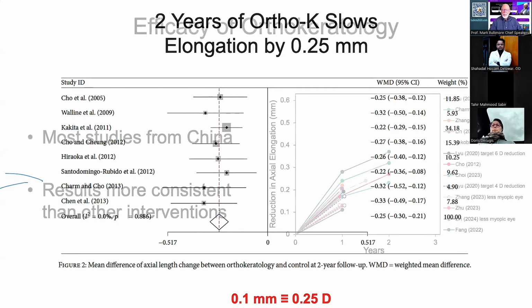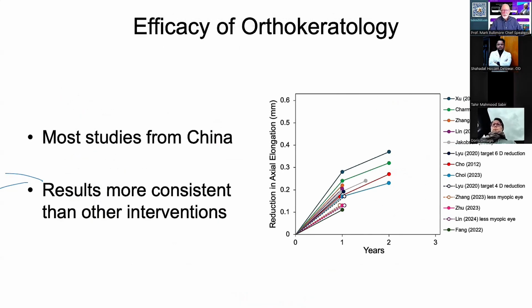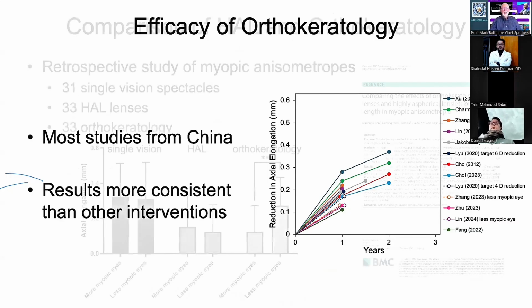And we see that, again, this is a figure on the right taken from our IMI review paper. And you can see generally the results are remarkably consistent, and much more so than other interventions. Now, some of the lines at the bottom where you've got less efficacy are actually, most of them, in less myopic eyes. And this is demonstrated quite clearly in this study.